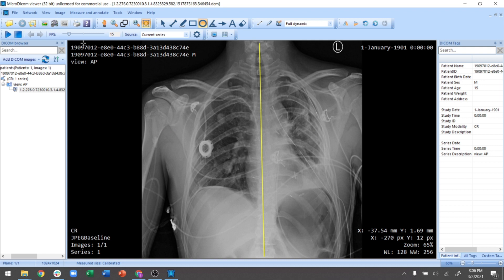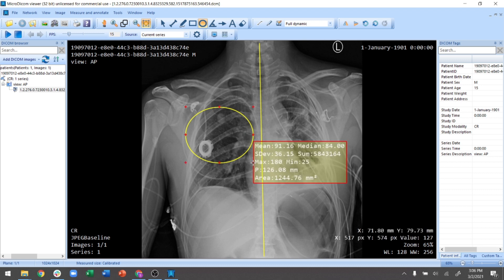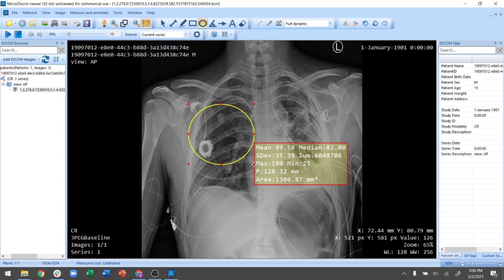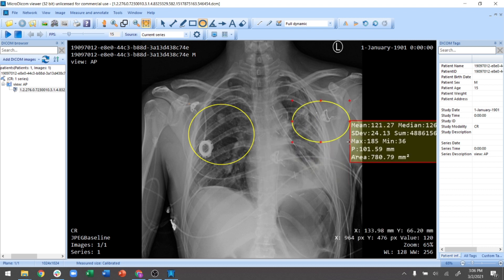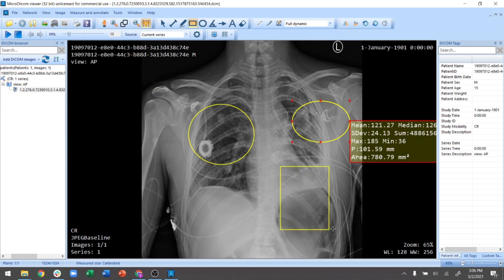A helpful annotation tool for machine learning is the ellipse. If you see pathology and point the ellipse at it, it shows you the mean and median of the pixels in that region of interest, as well as the area and maximum and minimum pixel values. You can keep bounding boxes where you think there is pathology, or use ellipses to annotate regions.